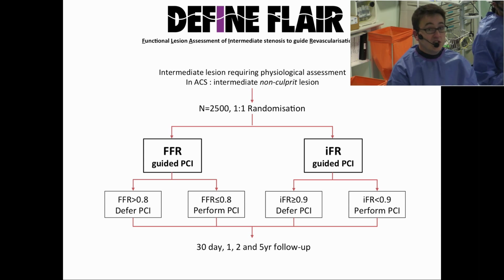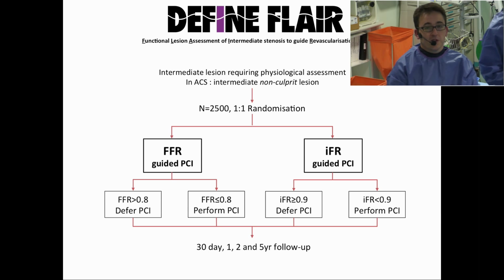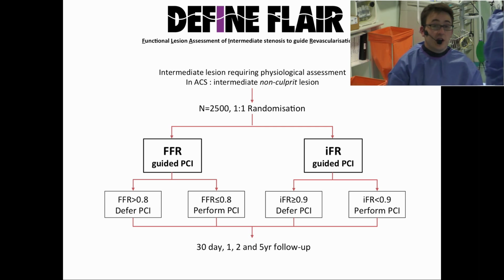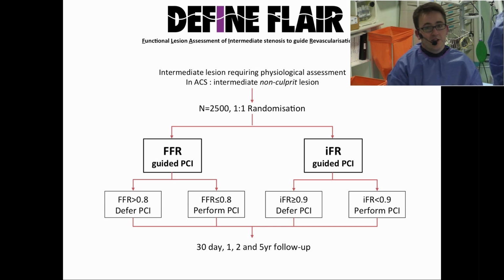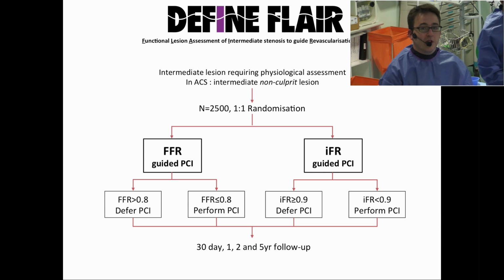Okay, so they're blinded to the patient which arm they're in, and they're also blinded up to the follow-up groups, either to FFR using a single cut point or iFR using a single cut point. And the outcomes here are going to be hard clinical events. First reported events will be at 1 year, but of course we're going to be tracking them through the studies. Other endpoints, which are very, very important for us nowadays with the hard economic times we have, is to look at cost effectiveness. So can we do these tests in a very safe and reliable way, which is key and important, but also saving time and other procedural costs which may be associated with hyperemic measurement.